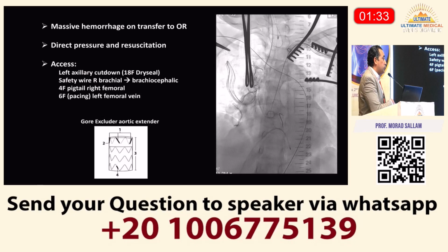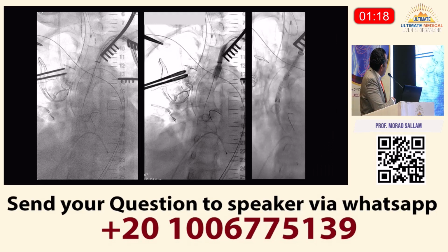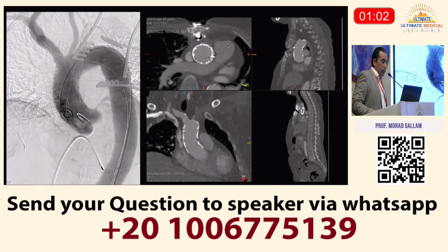So we used an Excluder, 45 millimeters, just because of the length from the coronaries to the innominate. It couldn't have taken anything more than that, with access from the axillary artery, and we ended up landing the rapid pacing. You can see here that the graft is being deployed. We came from the axillary because the delivery system doesn't get you from the femoral up all the way to the coronaries, and we deployed it on the rapid pacing wires and ended up with this.